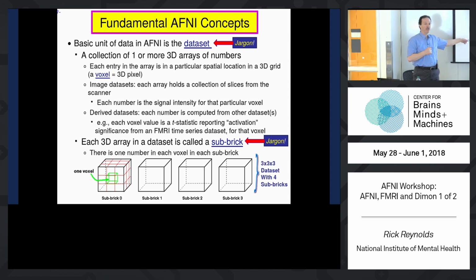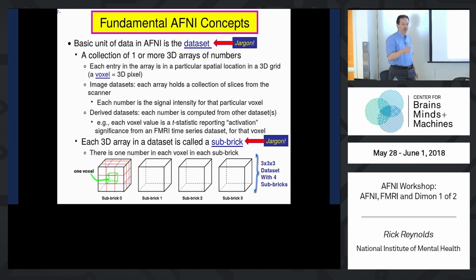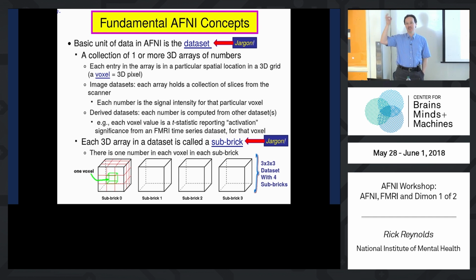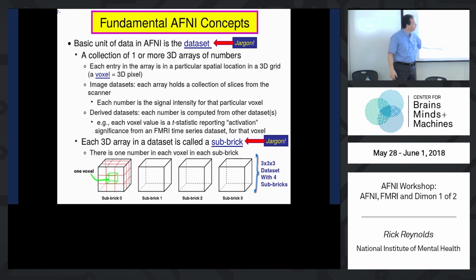When we talk about coordinates for a voxel, a volumetric pixel, so one of these little boxes in your 3D array, the coordinates for it will be the center of the box, the center of the little box. That's the actual coordinate for a voxel. It's unambiguous. If you assign it to a corner, which corner, there are 8 of them, panic ensues. We'll often talk about, so we have a four-dimensional collection of data here.